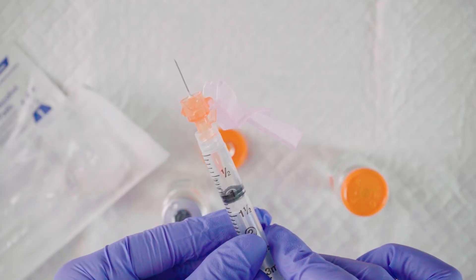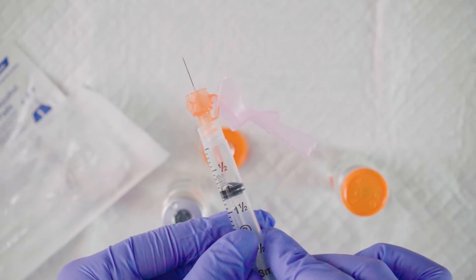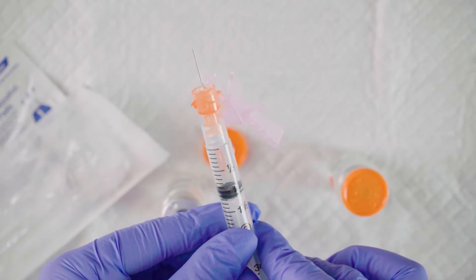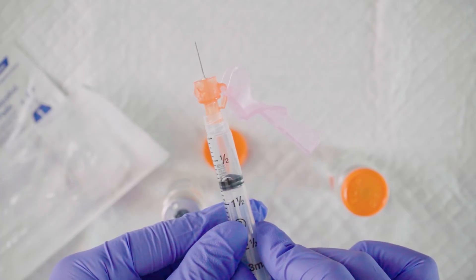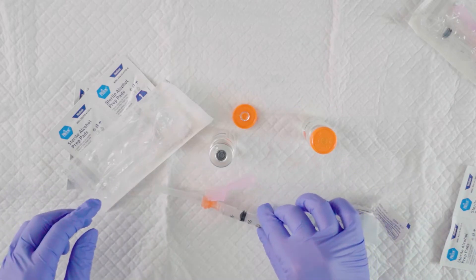Then we're going to remove the needle from the vial and inspect. If the needle appears bent, be sure to replace it with a new needle. We do this by carefully recapping the needle using the swoop method while preparing the injection site.